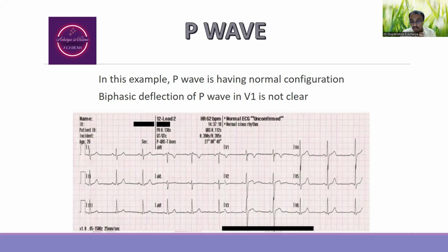So here also we can see the biphasic deflection in case of V1. That is also not that clear a pattern of biphasic deflection in V1 noted here.